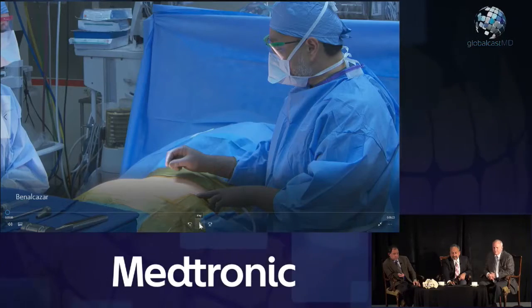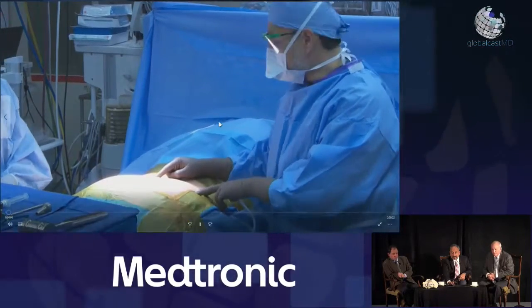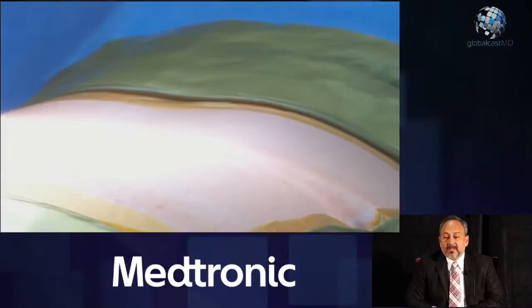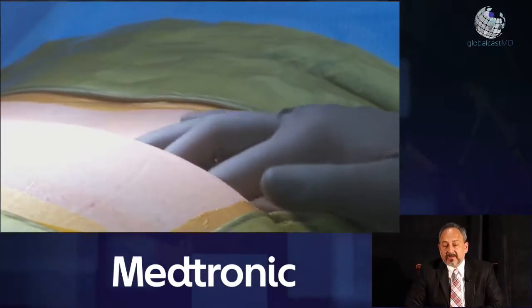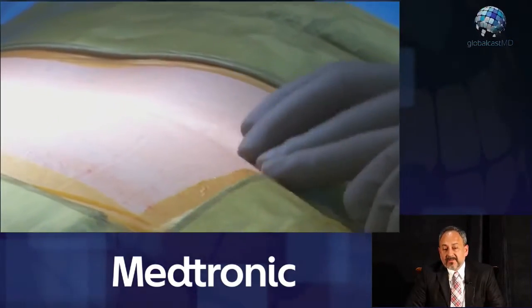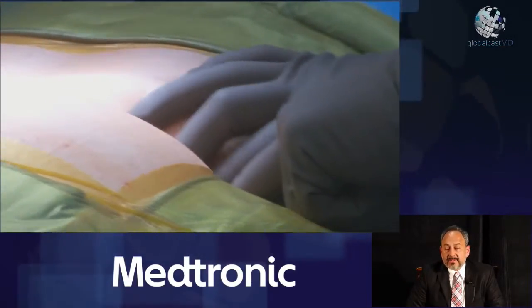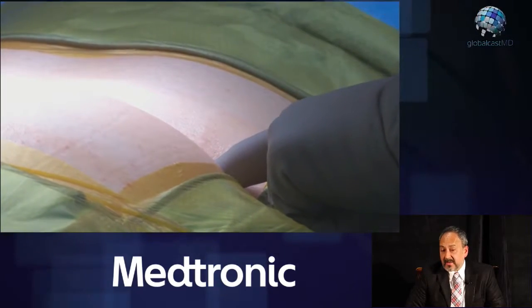We'll start this out and try not to bore everyone — this is not typically a spectator sport. So this is a patient who already had a unilateral SI joint fusion after suffering trauma to her pelvis. We fixed the side that was most symptomatic, and then afterwards she was scheduled to have the opposite side done.